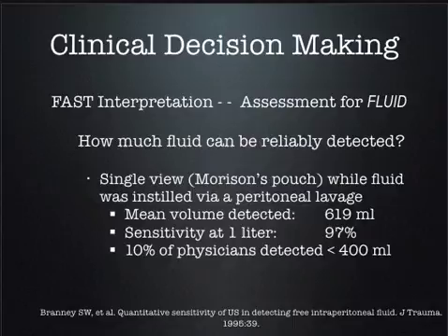Yeah, that's a fair amount of blood, right? A couple of units of blood in the abdomen. But that's not very much on a FAST exam, so it's hard to see. All of you guys can probably see a whole liter of blood. Is that a lot of blood? Yeah, a fifth of your blood volume in your belly? Yeah, that's a lot of blood, right?